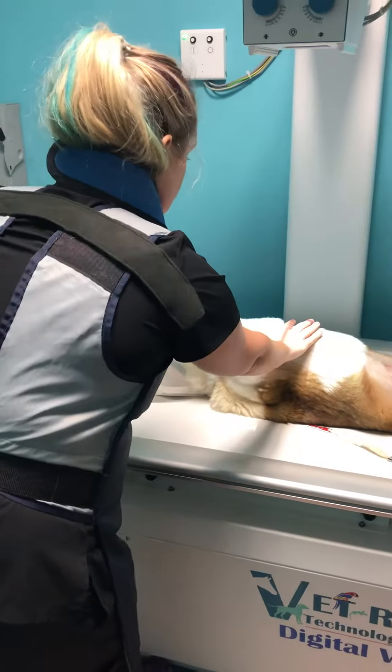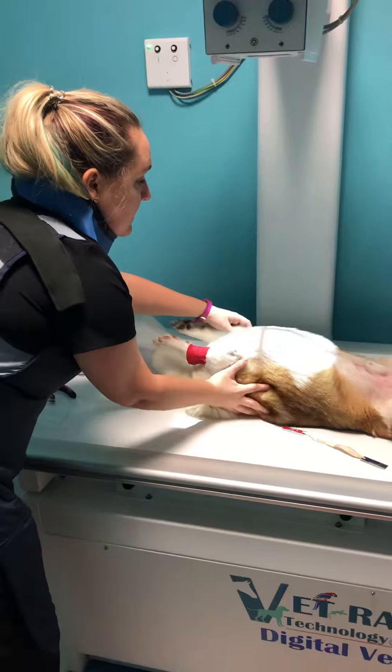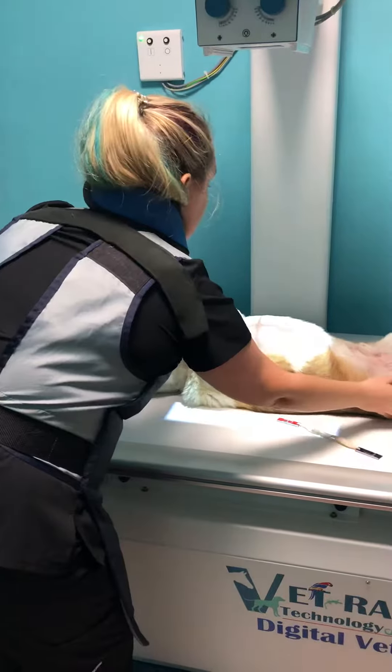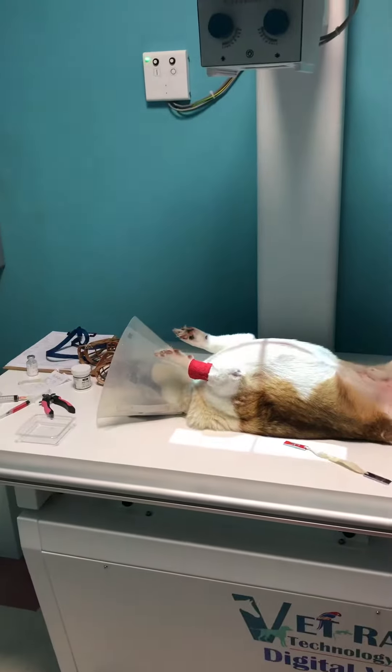He is under sedation right now, so we have him placed. We'll grab a few sandbags here so that he can be propped up on his side.